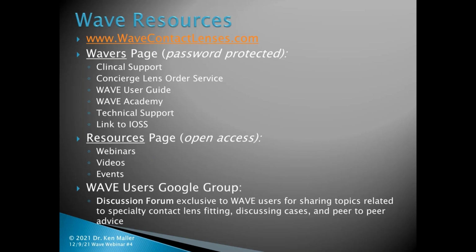Even including that LASIK case with that bizarre design that I had done with the 26 diopters of variance or 28 diopters of variance of power, I actually achieved 20/25 plus vision, and he was actually delighted with that corneal lens. So even out at the extremes, and that actually was even a case that a scleral lens failed on and failed miserably on, the corneal lens actually came in and saved the day.